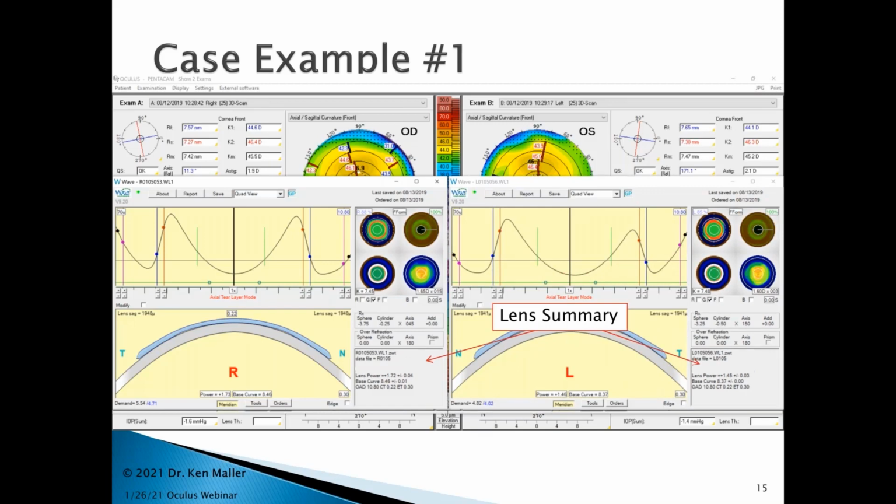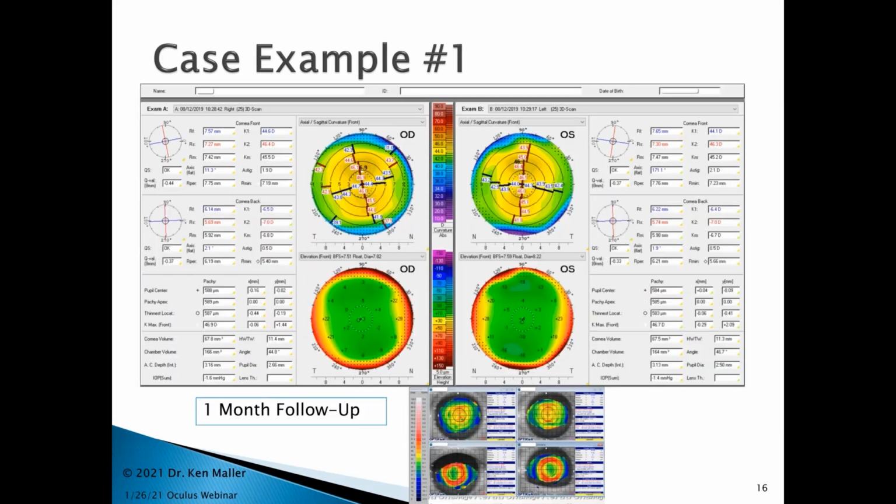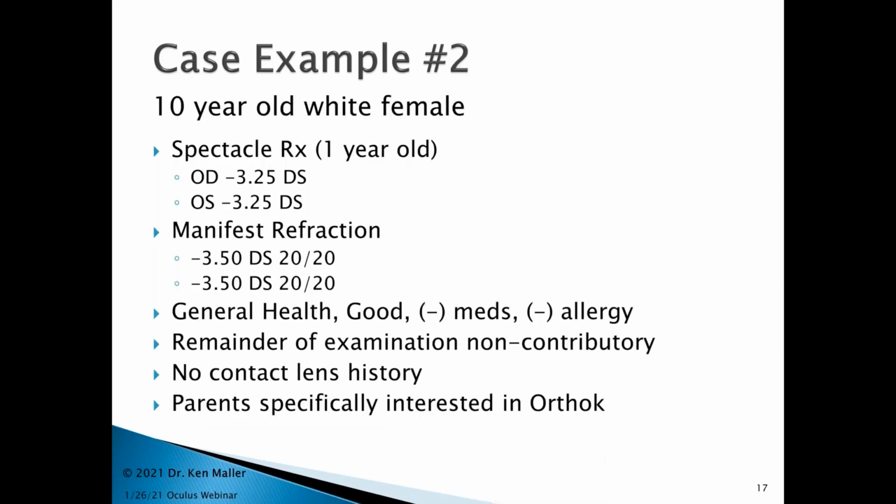and in this case here, you can see the initial data that I designed the lens from, and when I did the 1-month follow-up, you could see on the bottom there, I didn't happen to, in this case, take a Pentacam follow-up, but you can see on the Placido disc-based topographer at the bottom there that he did very, very well. All right, so let's go to case number 2.